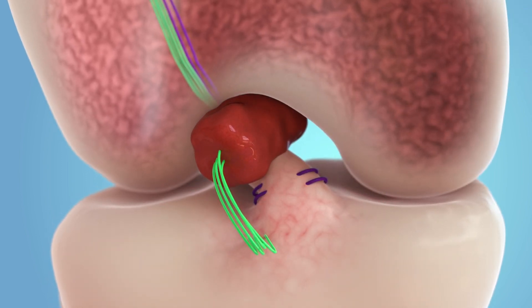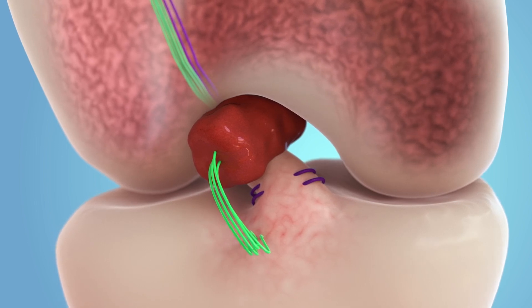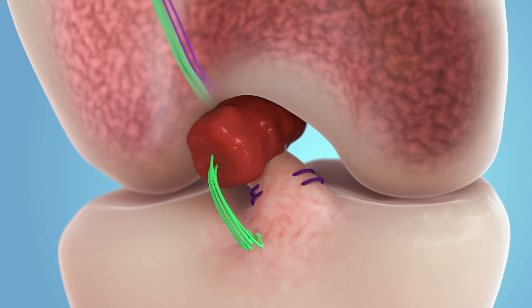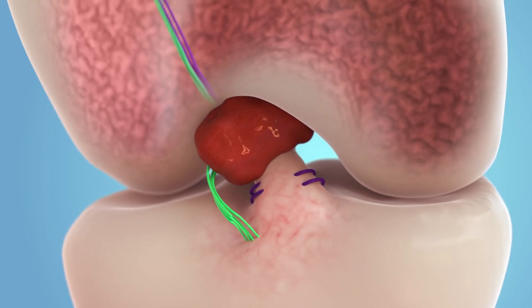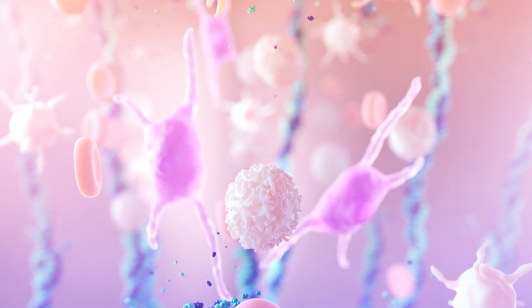The implant is then placed into the gap between the ends of the ACL, jump-starting the healing process and providing a bridge for the ligament to grow into. The surgeon then uses the sutures to pull the torn ends of the ACL into the implant.